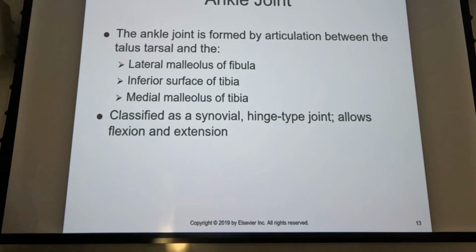So your ankle fractures, just real quickly, and we're going to get into this in a little bit and talk about highly unstable ankle fractures, but most of your ankle fractures are pretty stable. And I don't mean that the patient can get up and walk around on them. I mean the patient can pick their leg up and put it on the image receptor, okay? And that is because you've got, it's not unique to the leg, but you have these all over your body, what we refer to as a syndesmosis.